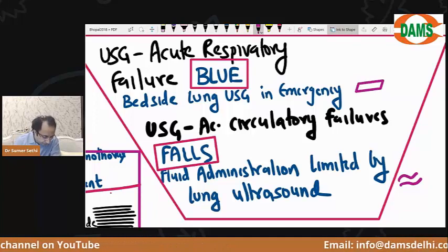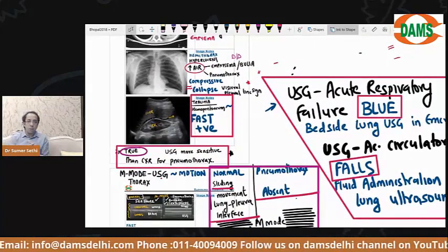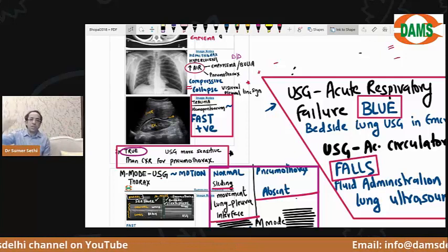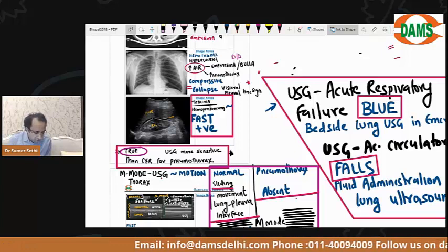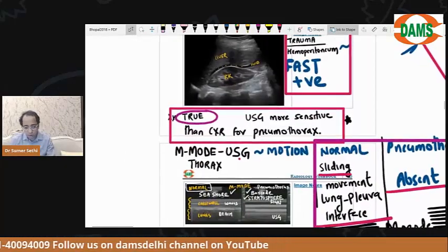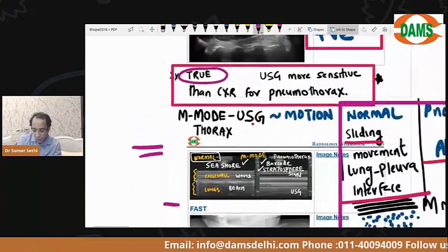Everybody follows? So now with this, we are finished with the discussion about pneumothorax. Very, very important. But because I had to use the word FAST, I explained a little bit about FAST so that you understand the words that I'm speaking. Everybody follows? All the chota bachas? The image where you are writing this, if you notice in your workbook, you will find this image, and some written word FAST. This is where you will write all this.